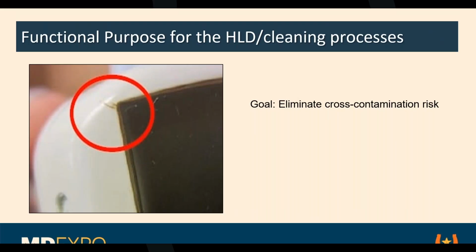At least do this, again, depending on what the intended use is for that device, the clinical setting. Is it susceptible to being banged, dropped? Does it have little cuts, or is it just like in labor and delivery where they're just looking to make sure that the baby's head is in the right position? Then that would tell you how often you might want to look at the probe for a visual inspection. Or if the sonographer says, look, I dropped it, I don't know, can you come and just take a quick look?